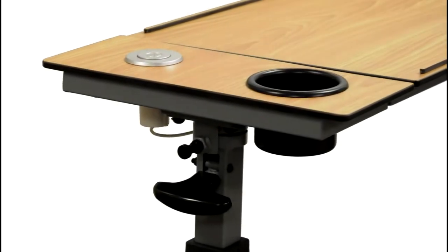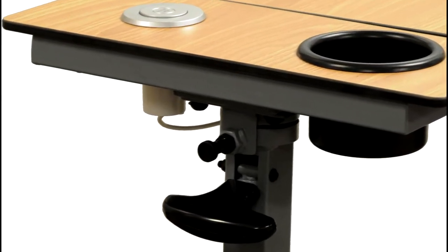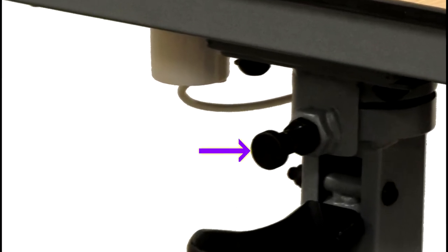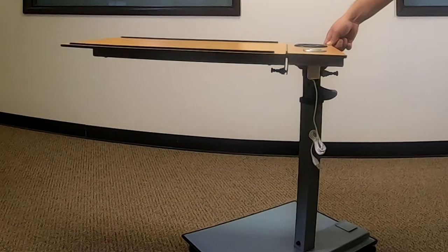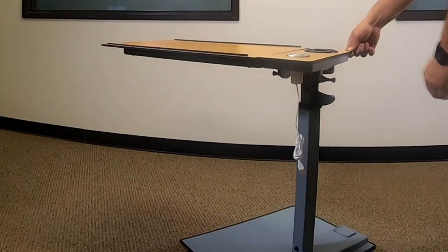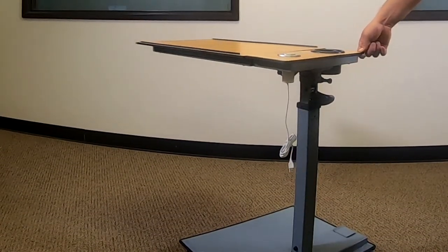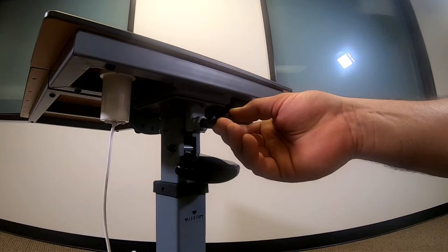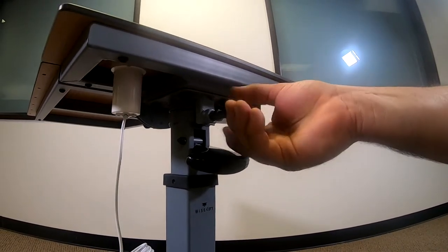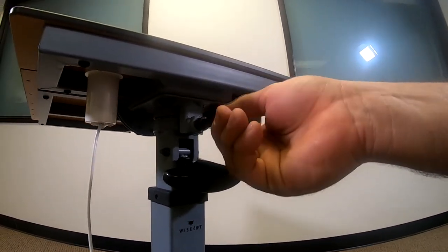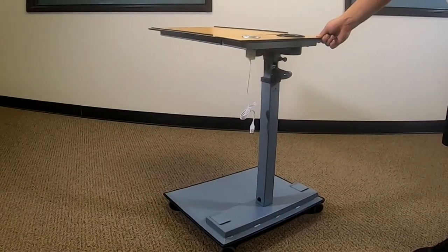When using the included casters, the swivel locking bolt must be installed to prevent the table from swiveling. The tabletop should always be positioned over the base for maximum stability. Insert the swivel locking bolt and tighten firmly by hand. Check to confirm that the tabletop does not swivel.